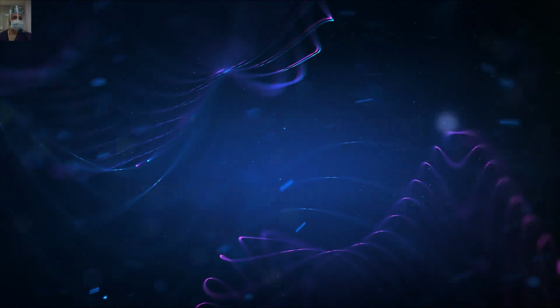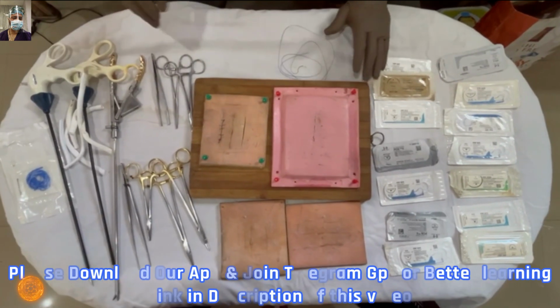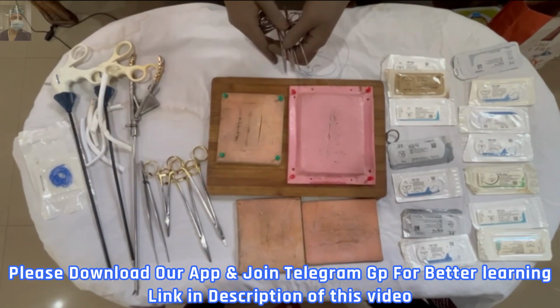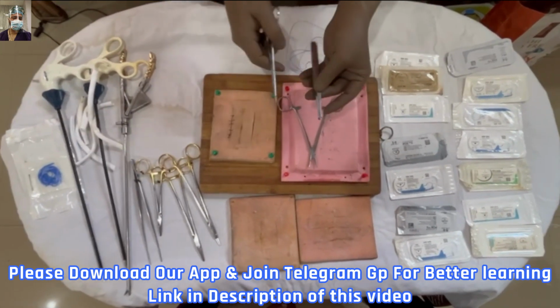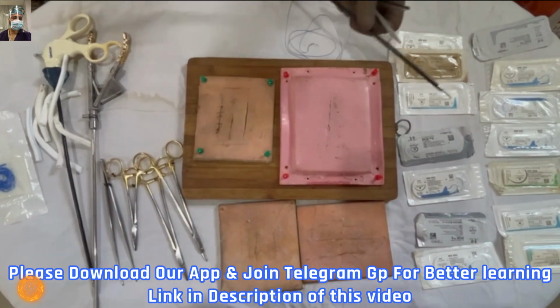First part, we will demonstrate instrument, knot tying and simple interrupted suture. So we have already showcased the basic instruments which a trainee should buy before even buying your books. And this was a needle holder, and the same needle holder I have demonstrated here, which I bought during my first year of surgical junior residency.